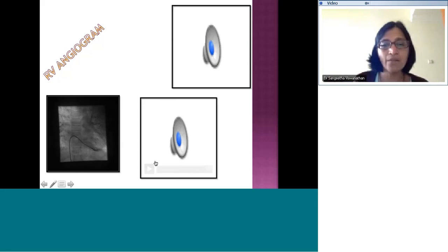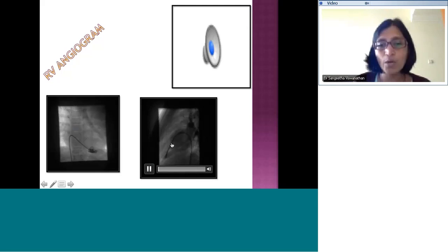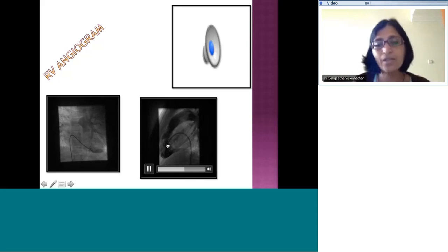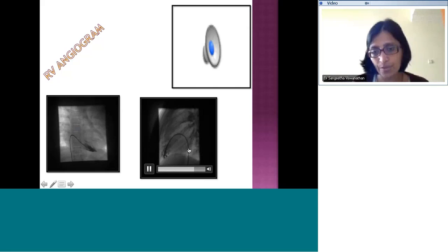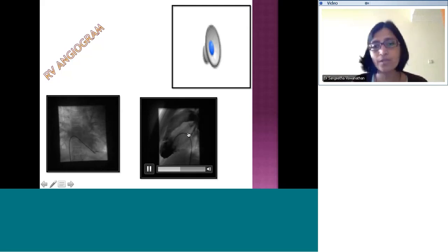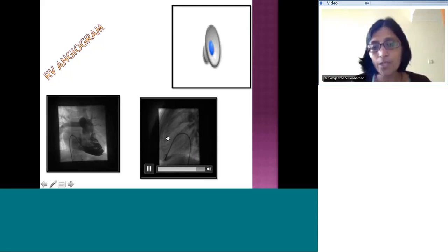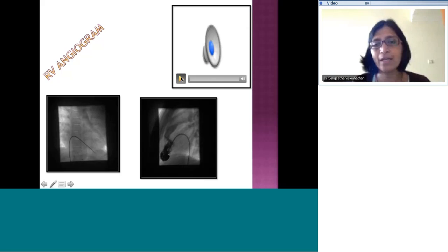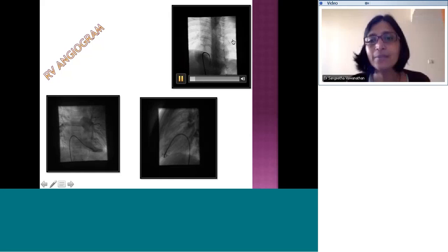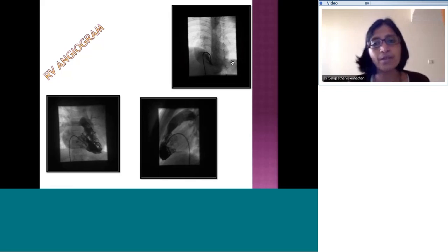In the lateral view of the same patient — the spine is here and the cardiac silhouette is separate from the spine confirming left lateral — you can more clearly see the muscle band in the RV. This is a patient with DCRV (double-chambered right ventricle). The lateral plane clearly shows the right ventricular apex, the RV outflow tract, the pulmonary valve, and the pathological muscle band dividing the RV into two chambers.